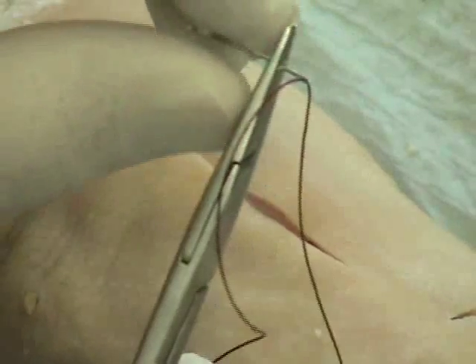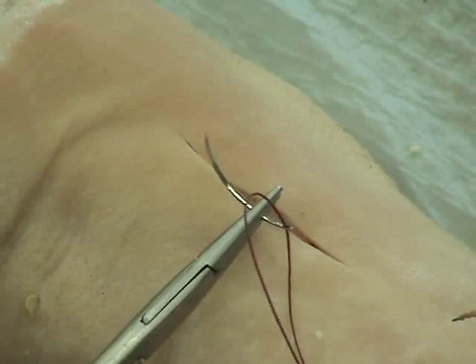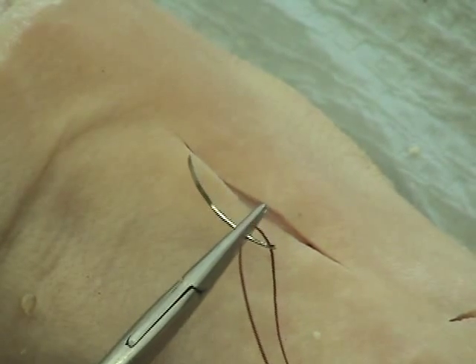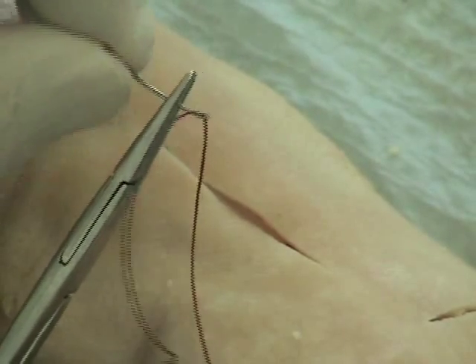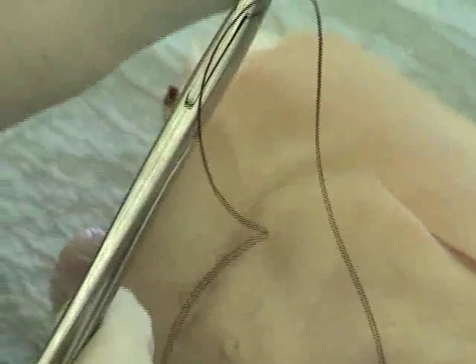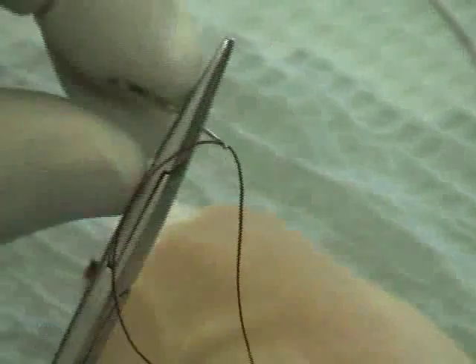I like to line up my needle holder with the needle coming out directly 90 degrees off. By lining it up perpendicular to the incision, I know that my needle is going in parallel to the incision line. If it's angled to one side or the other, we definitely have trouble. If your needle is flopping around, move it further down so it's locked into a wider portion — it will be much more stable. These are just some tips.